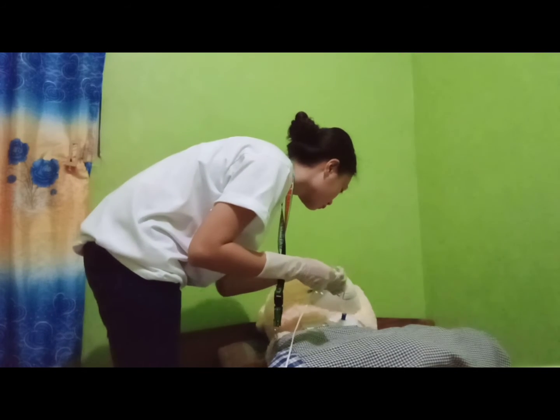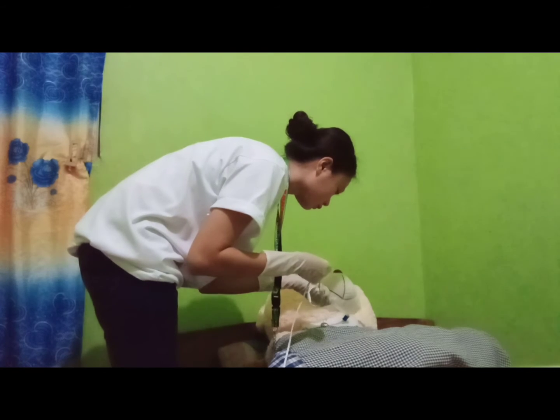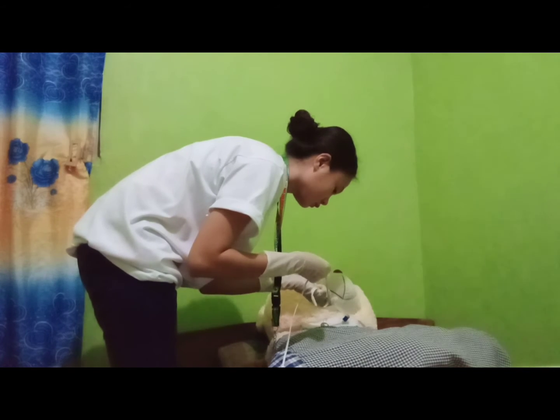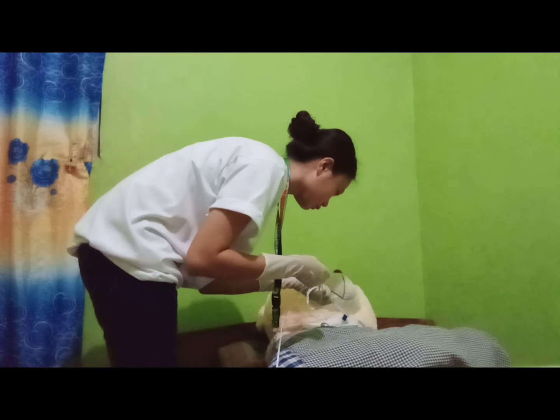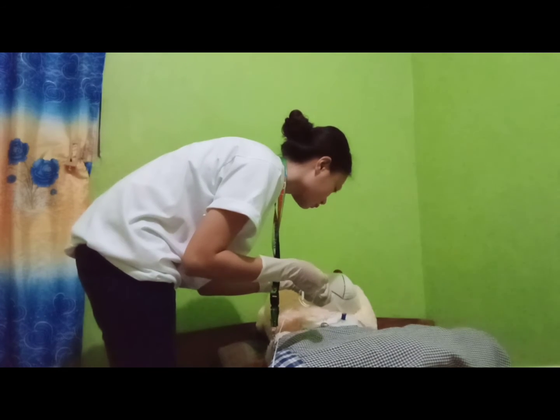Insert catheter into trachea through artificial airway during inspiration. Advance catheter until you feel resistance. Retract catheter 1 cm before applying suction. Note: client usually will cough when catheter enters trachea.